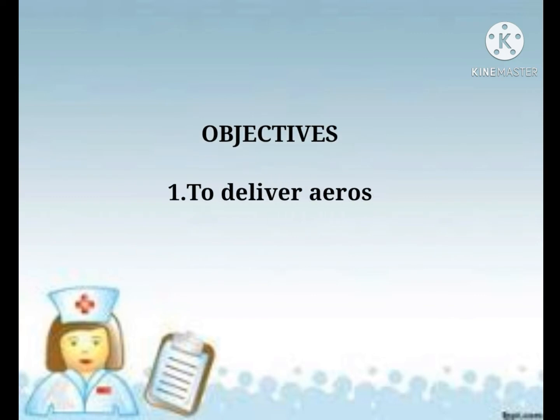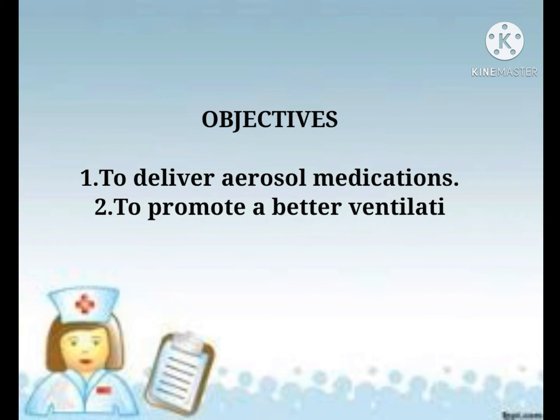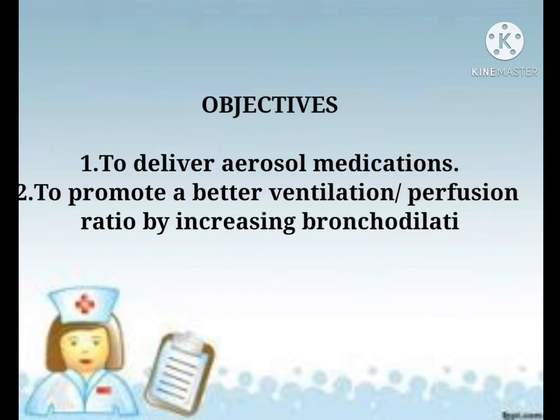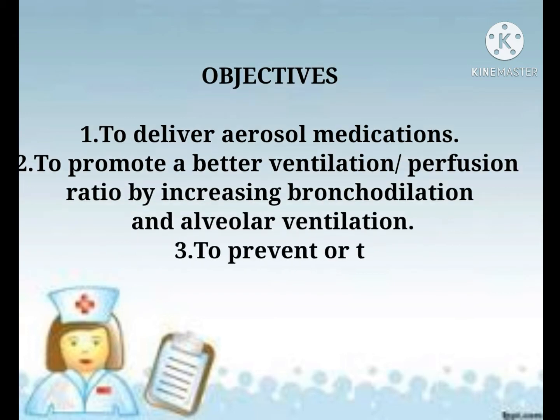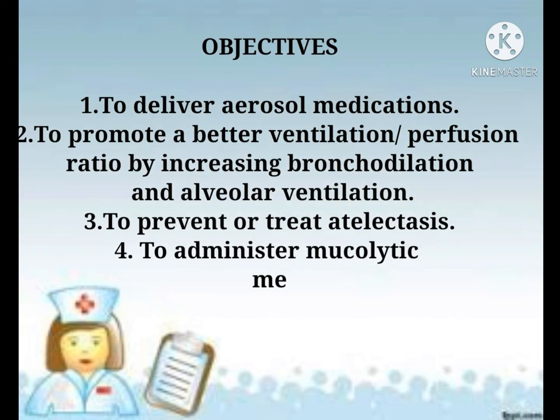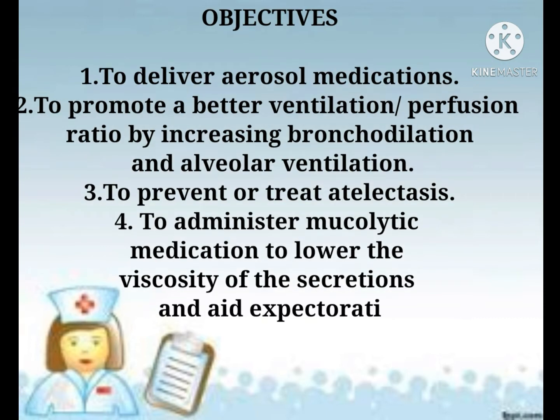Objectives. First is to deliver aerosol medication, to promote a better ventilation perfusion ratio by increasing bronchodilation and alveolar ventilation. Next is to prevent or treat atelectasis. Next is to administer mucolytic medication to lower the viscosity of the secretions and aid expectoration.